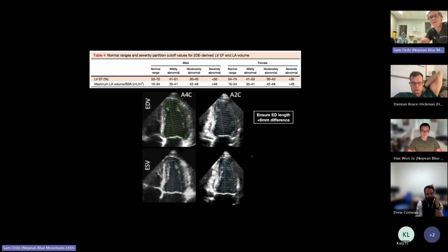So let's talk about the eyeballing. So you're going to have an eyeball method to try and assess it. And then the next part is if you're going to go and do measurements, to try and make sure that that measurement as close as possible backs up your bias. I'm being facetious, but it's really easy to make mistakes with this. But at least when you're looking with your eyeball, you've got to have an idea of what it sits at. So that if you start getting measurements that are way different from what you've eyeballed, you've got to ask yourself a question, have you got it wrong or have you made a measurement wrong? And the better you get with your measurements and your eyeballing, I think most of the time it's normally the measurements that have some of the errors, in my opinion.